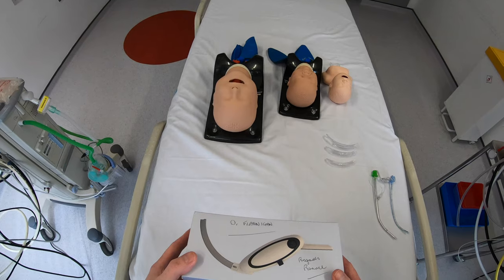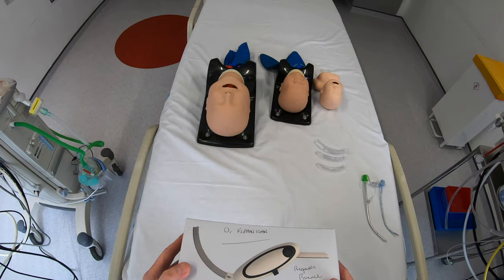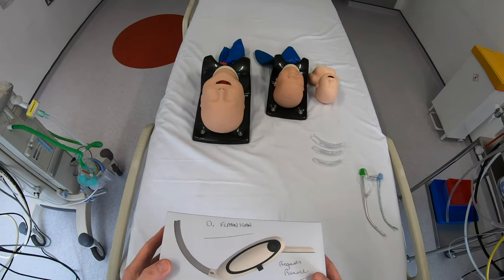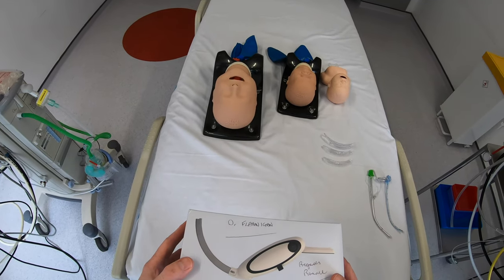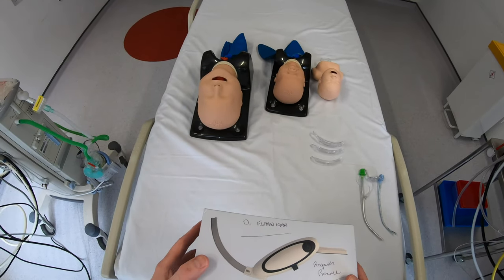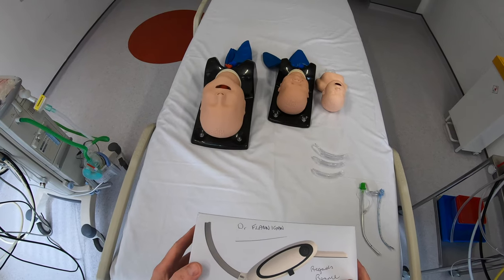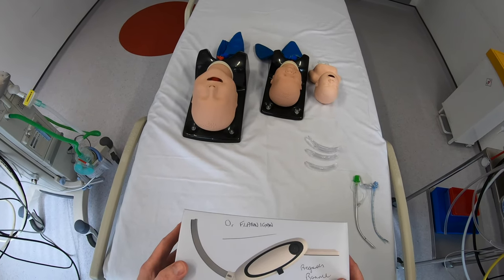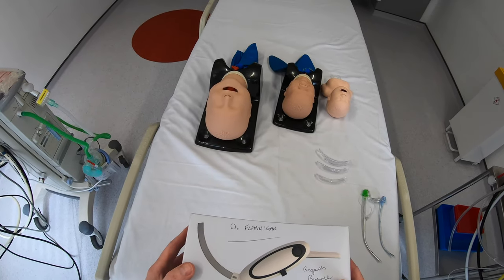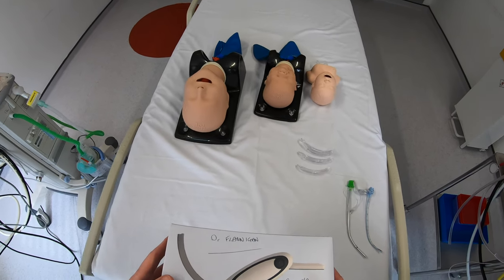I haven't had that much experience of it until now, and part of the reason for that is it hasn't offered a recording feature, which has been something quite important to me. I'm fairly late to the party when it comes to the McGrath MAC, but having reviewed so many other video laryngoscopes, I want to put my opinions out there — and comparing it to others will be useful even if you're fairly familiar with this device.